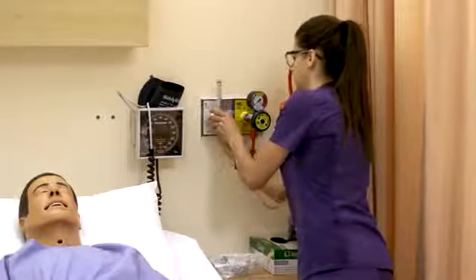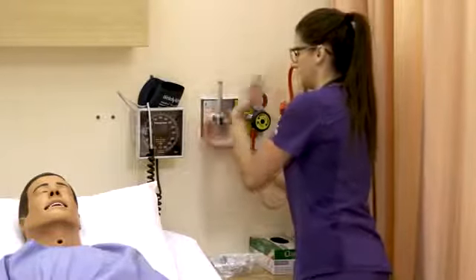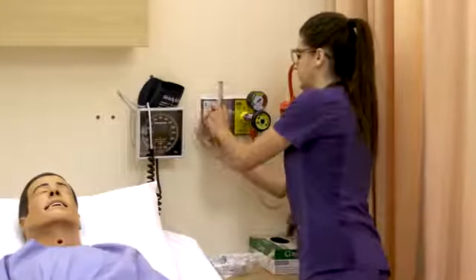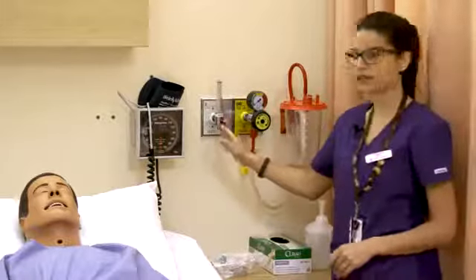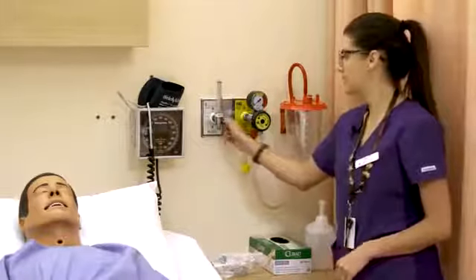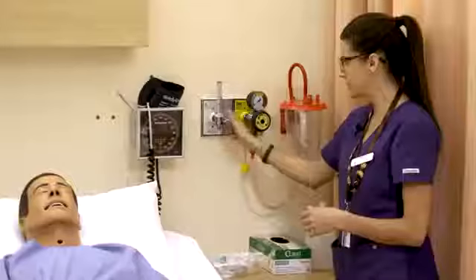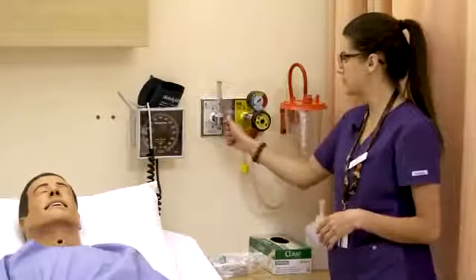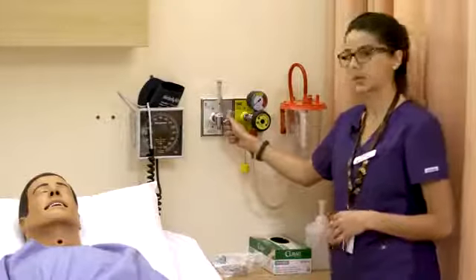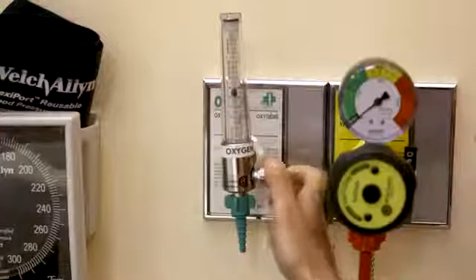If you don't know that it makes that sound, it can be a little bit shocking at first. It also does a blast of air in your face. So there, now our flow meter is on and attached to the wall, and you'll see right away that if you turn the dial towards you, you can hear the sound, and this little ball in here will start to rise. And there are liters per minute markings on the side.